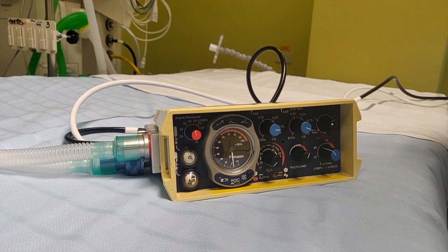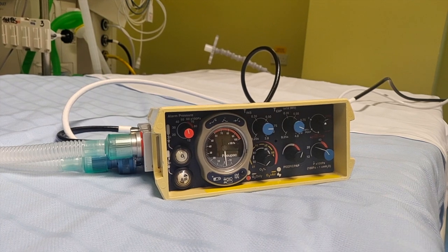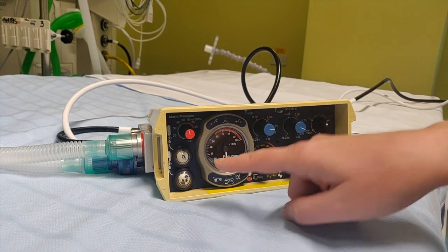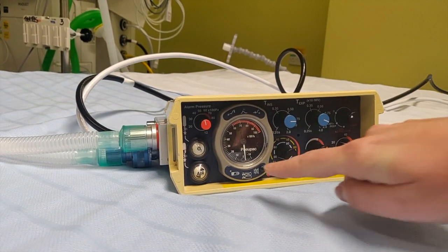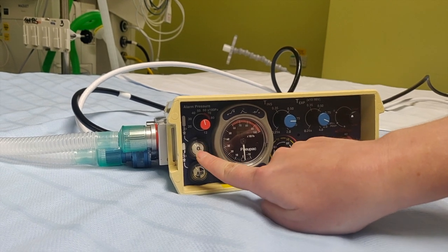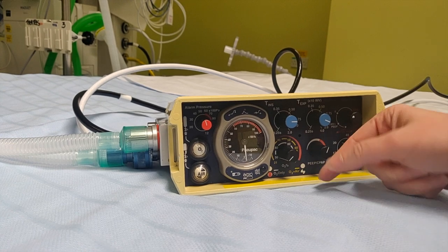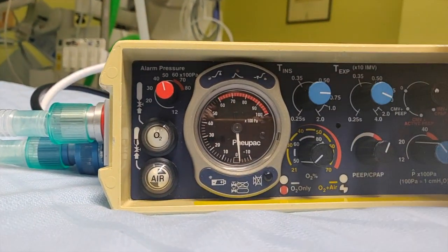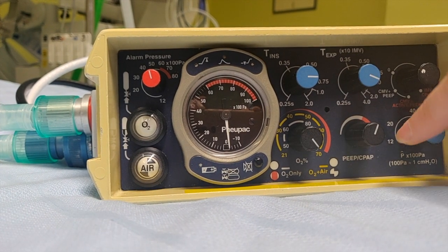This ventilator is for neonates and infants and has some particularities. We have this ventilator already plugged to both air and oxygen — you can see this because air is white and O2 is also in white. This gives us an FiO2 range from 21 to 70, via the yellow dial.